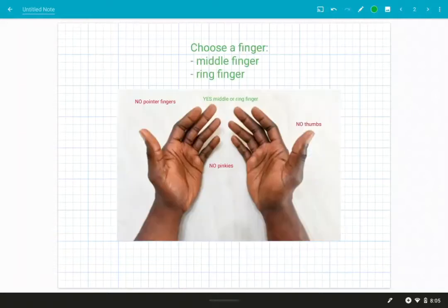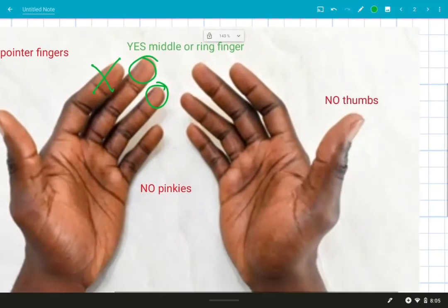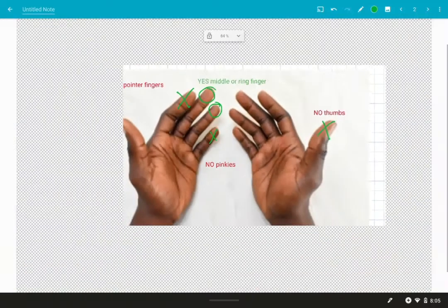When you choose a finger, you always want to go for the middle or the ring finger. You don't want to go for the pointer finger because the skin is thicker and it's a little bit harder to get that blood going. The thumb is also thicker and it has a pulse, so there's a higher risk for excessive bleeding. And then pinkies have thinner layers of fat and thinner skin, so you have a higher chance of hitting the bone, which can cause an infection. It will definitely cause pain, and in general is going to cause pain even if you don't hit that bone.